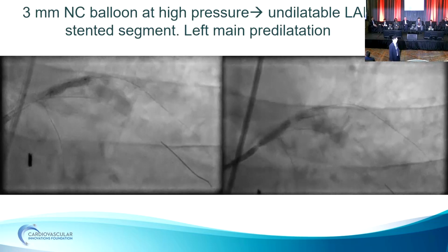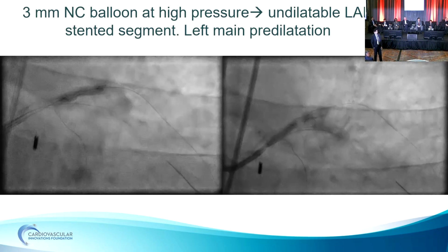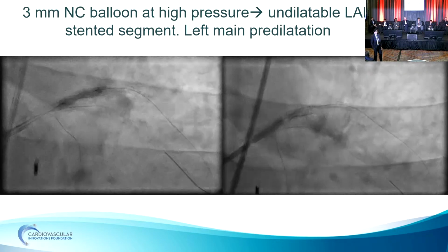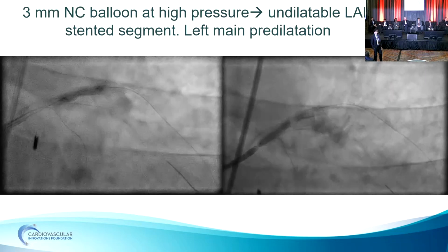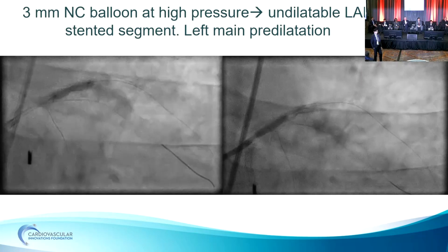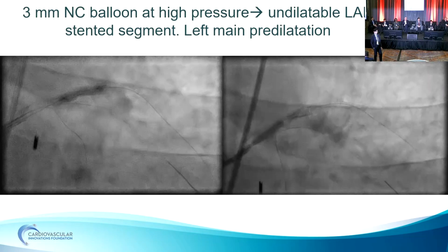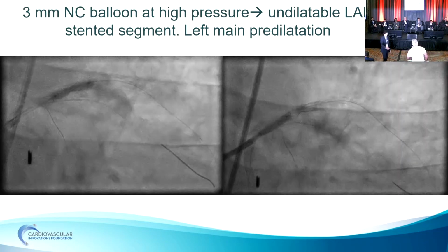At this point, I want to emphasize one thing more. We have 2 accesses from the femoral artery and severe calcification here. After attempting such kind of device-related interventions, the risk of rupture is so high. So we have to prepare for one more access before attempting, just to prevent it. Because if you fail, you do not have time to get a new access because the patient will fail because of the rupture. So just one more access for artery from the radial maybe.